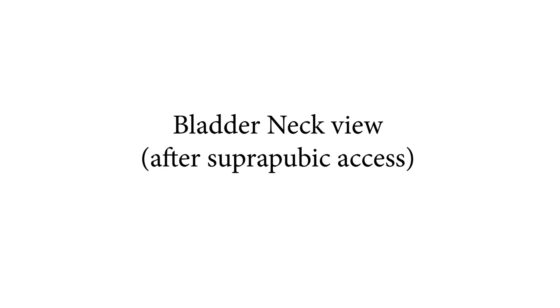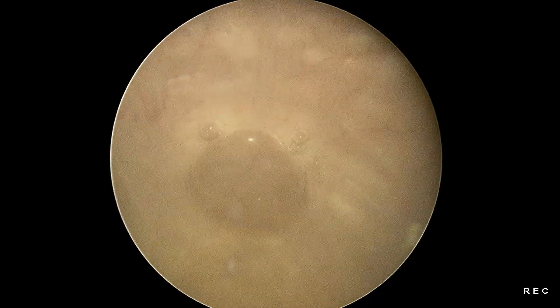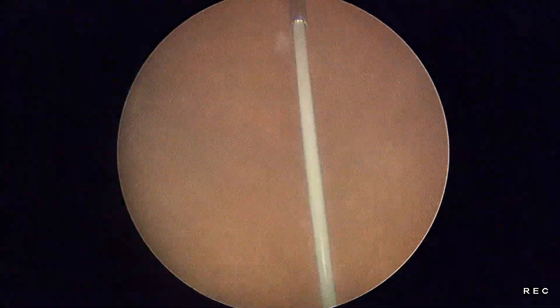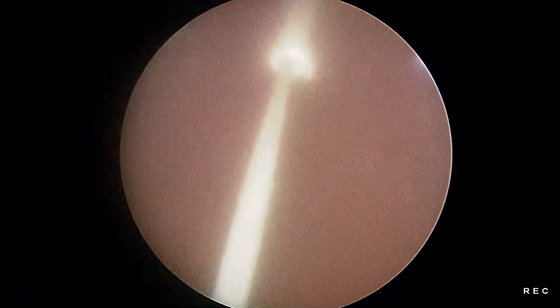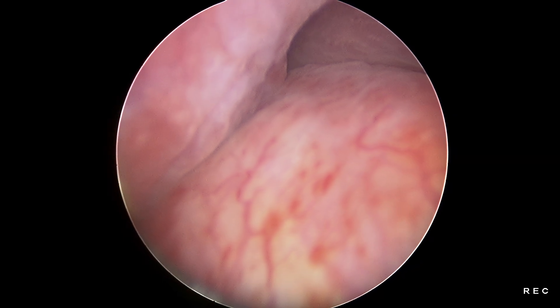Bladder neck view after suprapubic access. Cystoscopic view of the bladder — the appropriate puncture site is chosen in the suprapubic region. Suprapubic puncture is made with a PCNL IP puncture needle. A guide wire is passed into the bladder and further retrieved into the urethra. The suprapubic puncture is dilated first with a fascial dilator and later with the Amplatz dilator over the rod. The size of the Amplatz dilator is decided as per the procedure — STSARP or Mini STSARP. Finally, the Amplatz sheath is placed over the dilator into the bladder.